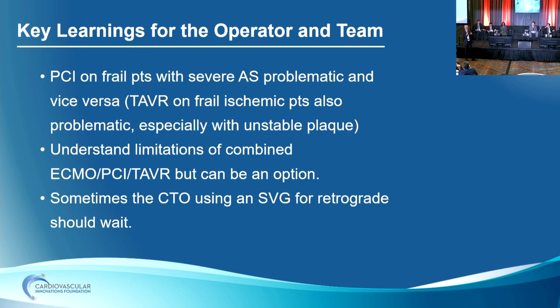Oh, you're saying after you're on ECMO, then do the TAVR first? Or no ECMO, yeah. So that would be the only comment. Yeah, I kind of glossed over the TAVR parts of it, but it was a relatively straightforward 26 Sapien 3 case. There weren't any particular watchouts on the valve.